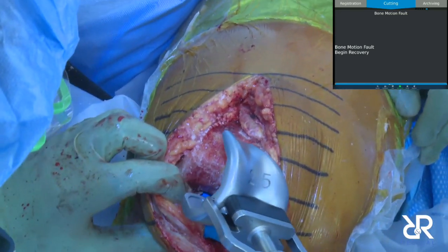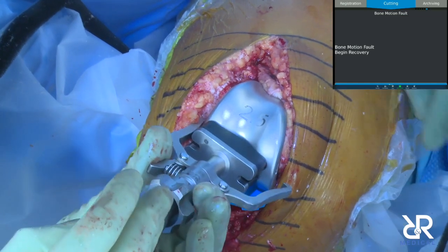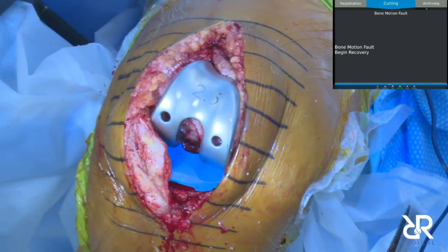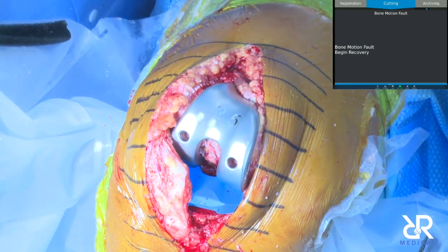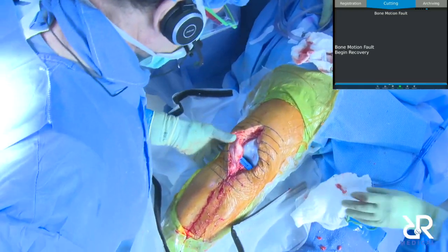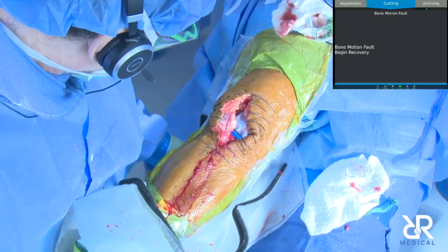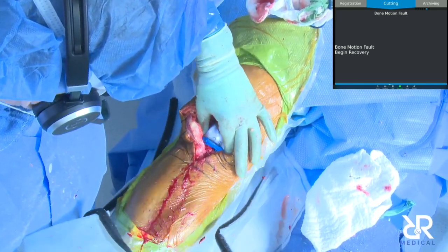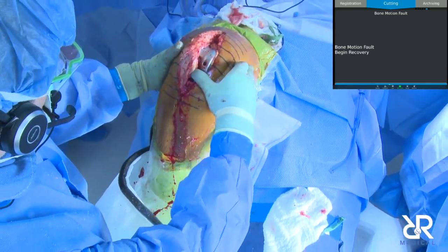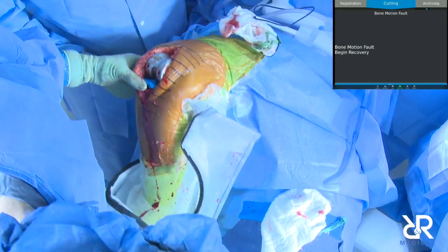Okay. All right. I just put in 11. Zoom out, Roger. So that feels really good. Gets full extension. That femur all the way down. What size femur was it? 2.5. Okay.